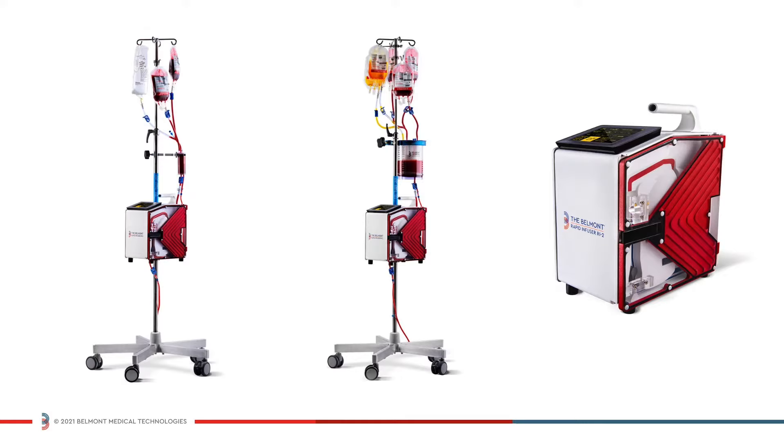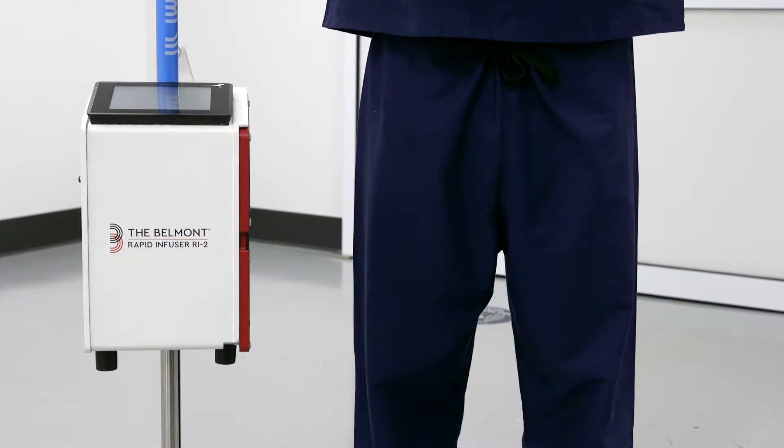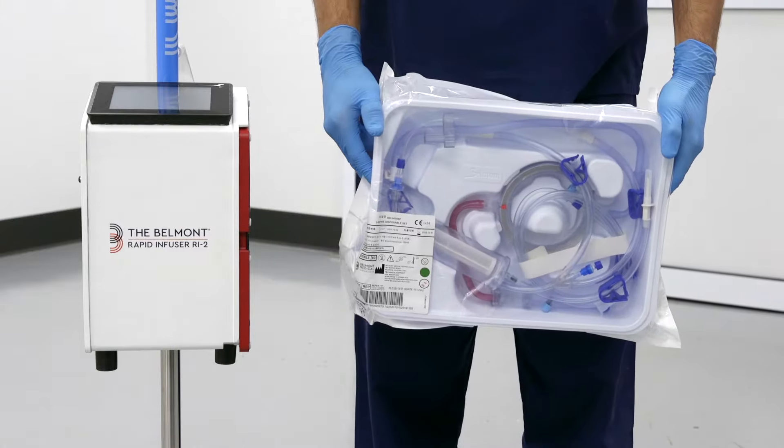The Belmont Rapid Infuser RI2 consists of two main components: the control system, which is mounted on an IV pole, and the disposable set.